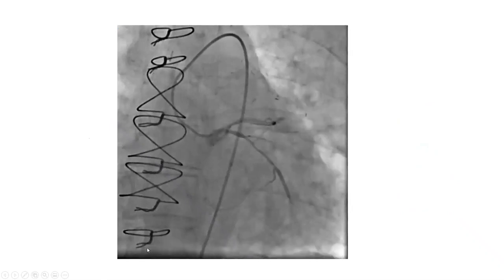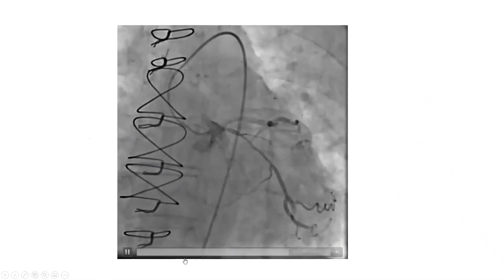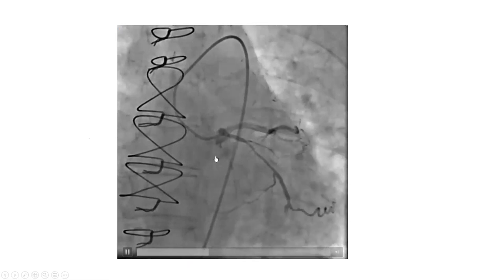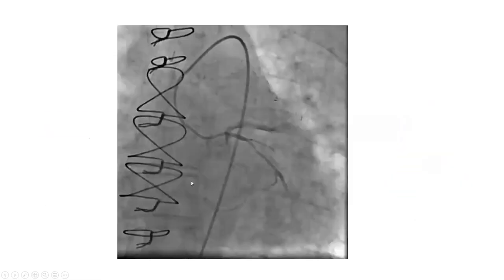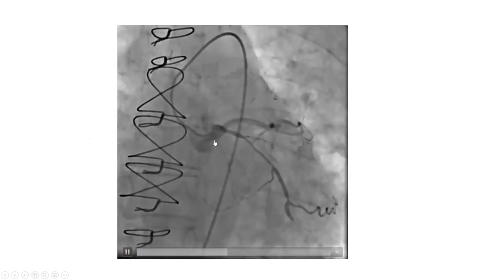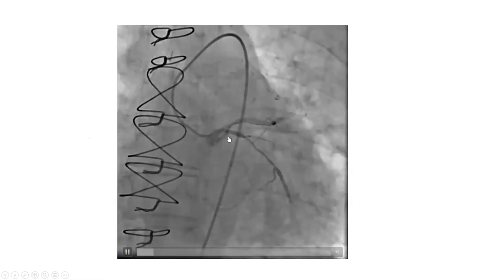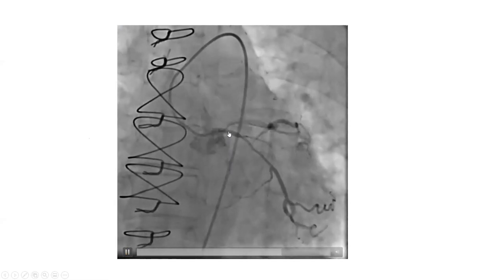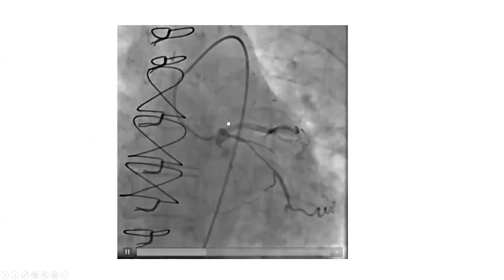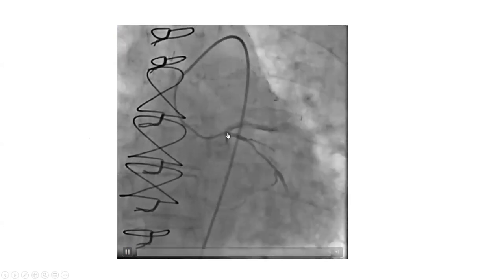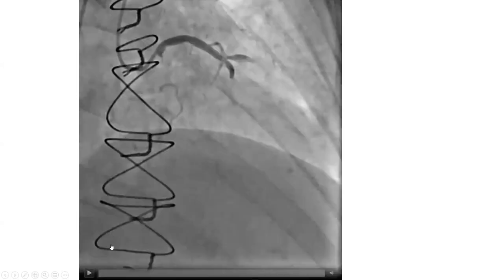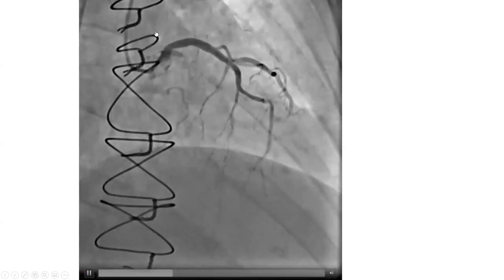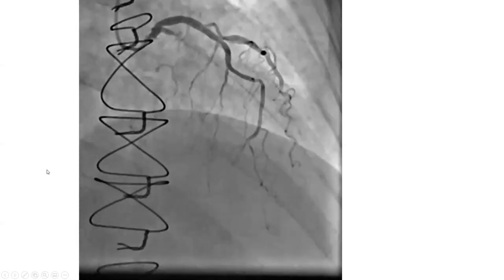Here's that case — same patient. We used the same catheter, already very short JL3, counter-clocked, pulled slightly to get out of the circumflex and toward the LAD. With a puff we confirmed we were going in the right direction, counter-clocked further, and got well into the LAD selectively.